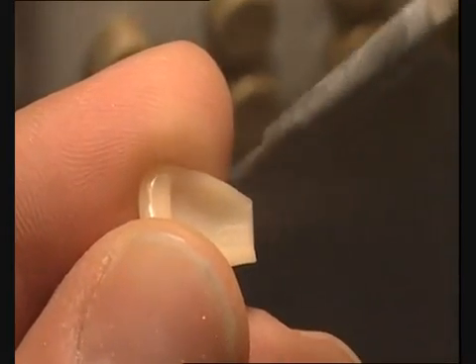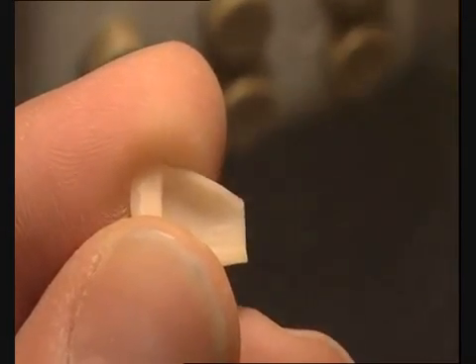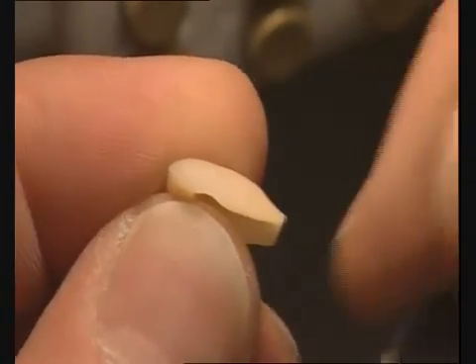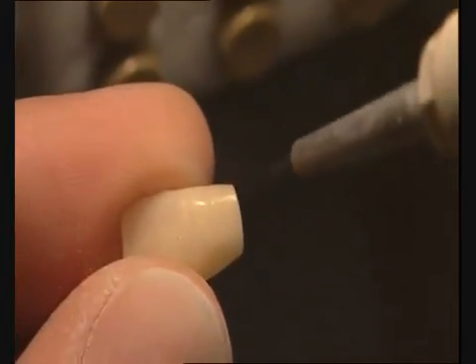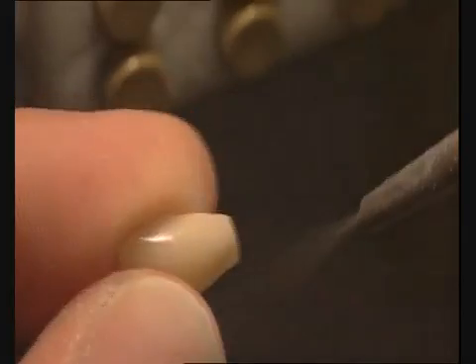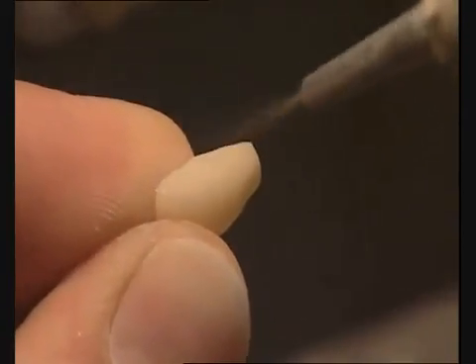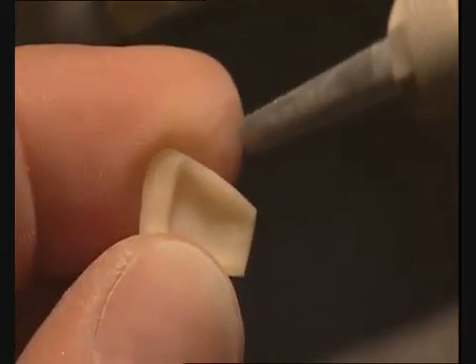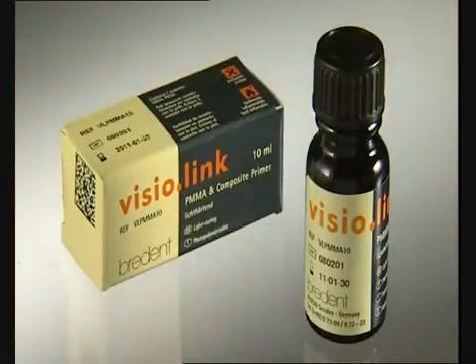The Novo line veneers are then roughened by sandblasting with 110-micron grit size aluminum oxide at 2 to 3 bar pressure. Sandblasting over the margins of the veneers saves conditioning them again at the finishing stage or when customizing the veneer with Cree line.